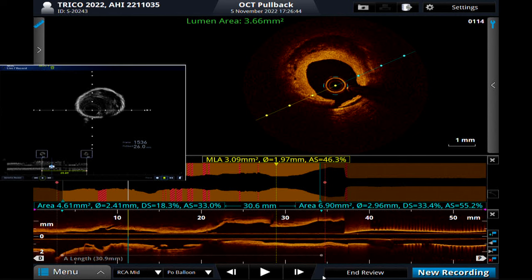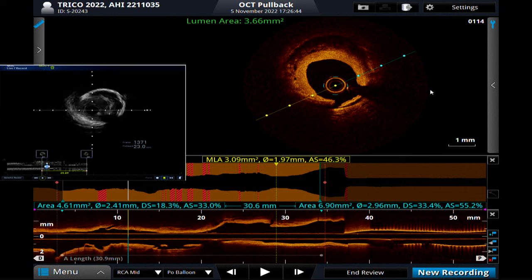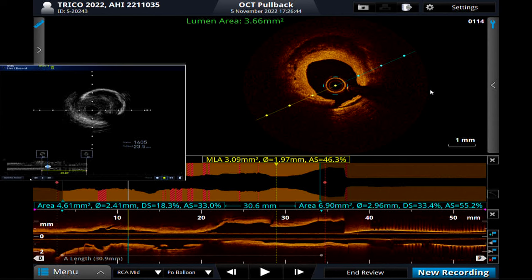These OCT findings on the right side are very interesting. The intimal side shows high signal, homogeneous. The bottom is lower signal — not as sharp. This could be intraplaque hemorrhage. We can also identify some tiny holes.